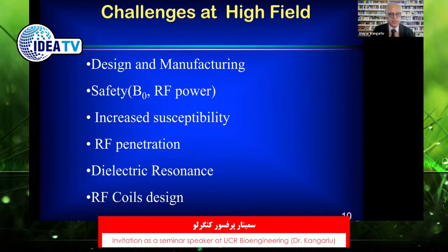And microwave, we know through your experience with your home microwave oven, heats water up. Water absorbs microwave very effectively, and that was a big concern: both the fact that absorption will result in attenuated RF, and that attenuation is at the cost of generating heat and heating of the subject.